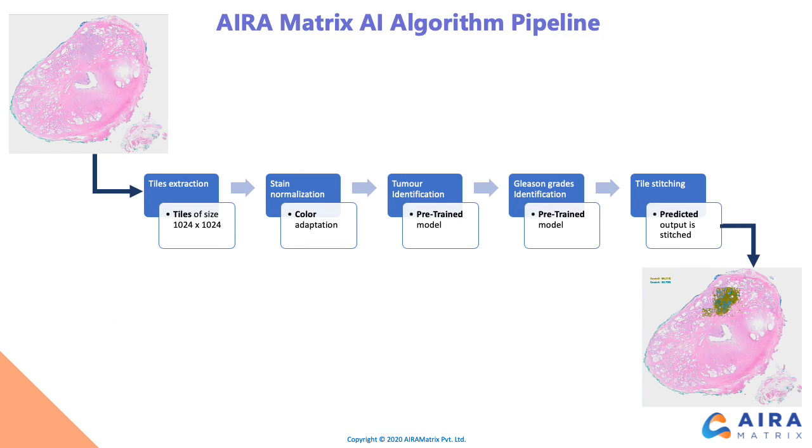One of the main challenges we encountered while transferring or retraining our deep learning models was to generate a labeled dataset. A single RALP image has close to 30,000 to 50,000 relevant glands, which are incredibly cumbersome to mark manually. To circumvent this challenge, we have developed a continuous learning framework. The pre-trained model from needle core biopsies is used to generate rough annotations on RALP images, which are later refined by the pathologist, and then the training continues. This process repeats 3 to 4 times till the model converges to the desired accuracy.